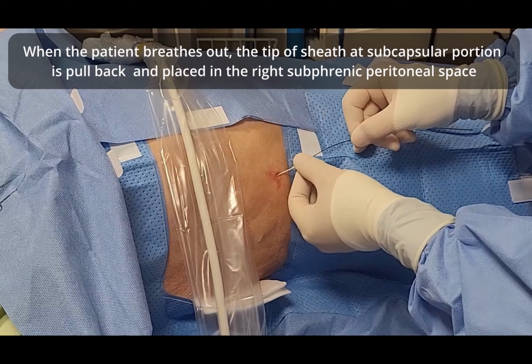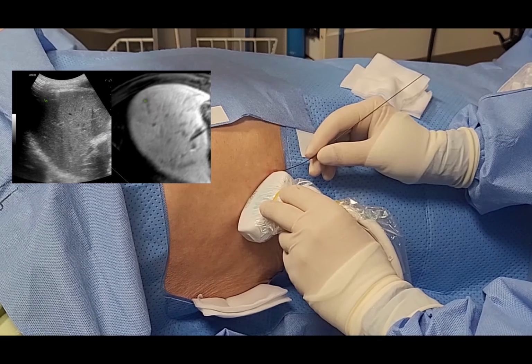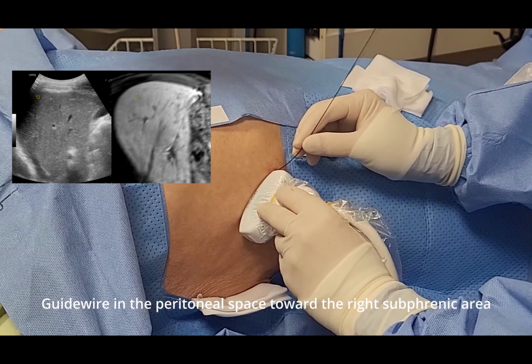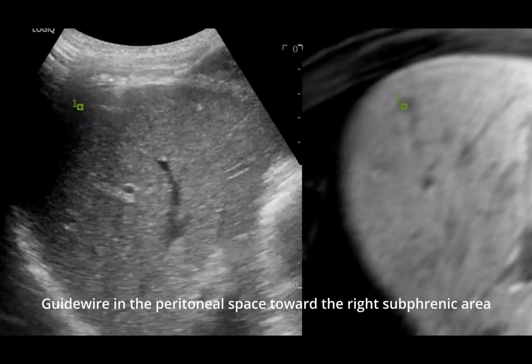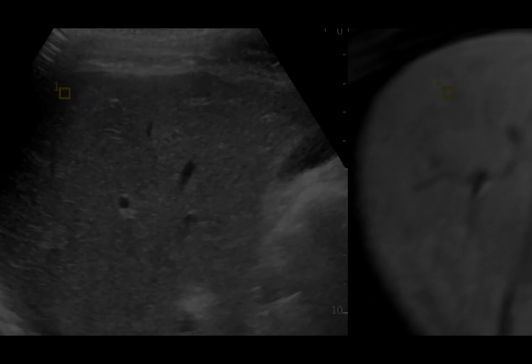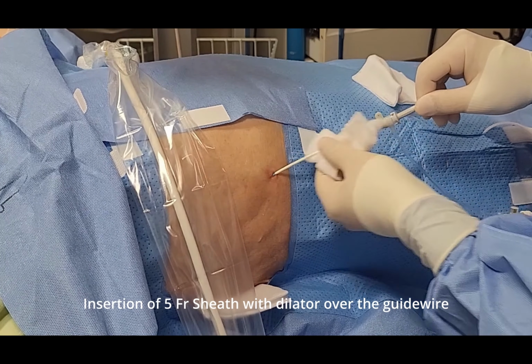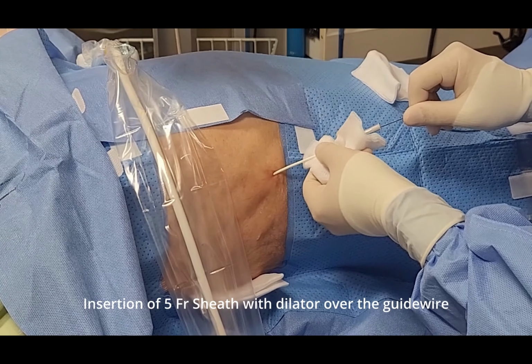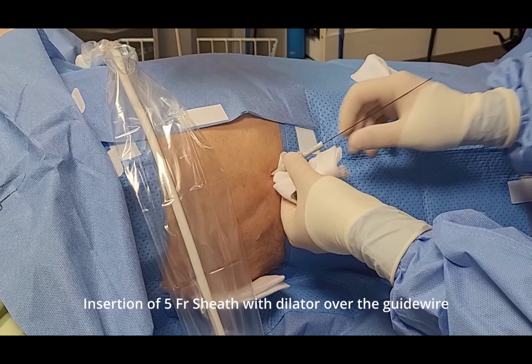At that time, I insert the guide wire and change the dilator. It's very simple. If you have experience of angiography, I strongly recommend making artificial ascites using angiography. You can see the sheath, the narrow space between the capsule and liver, peritoneum and liver, and change the guide wire, sheath, guide wire, 5 French. It takes just 3 minutes, I think, so we can invest the time.